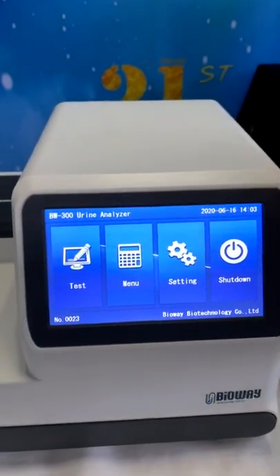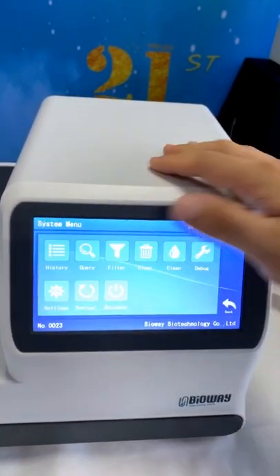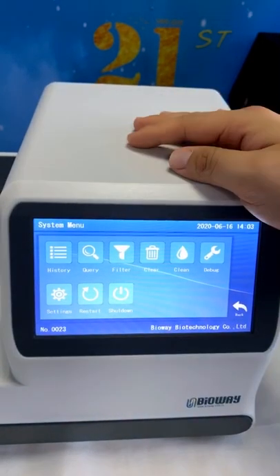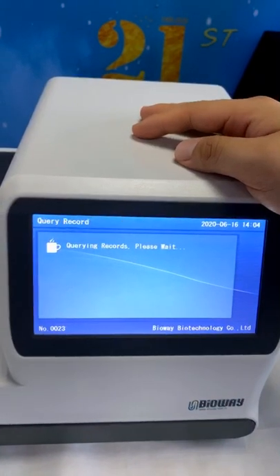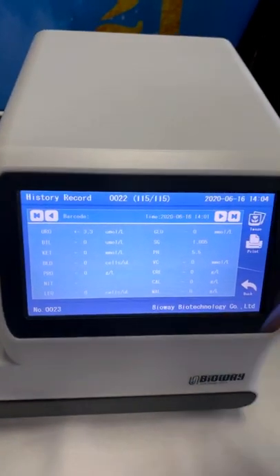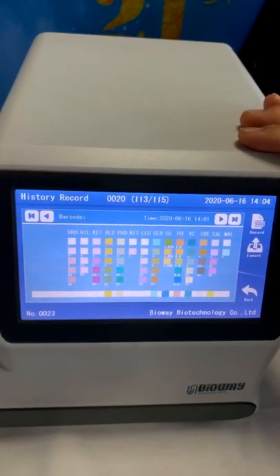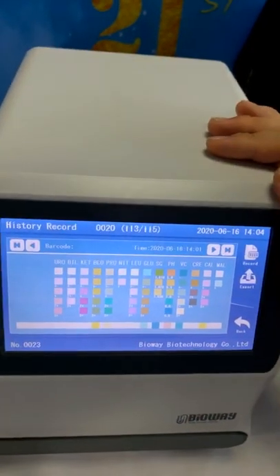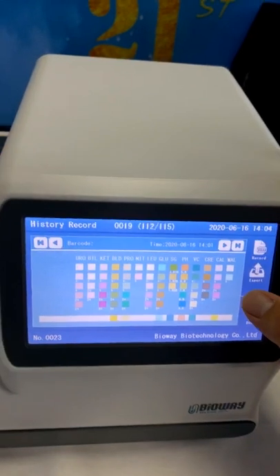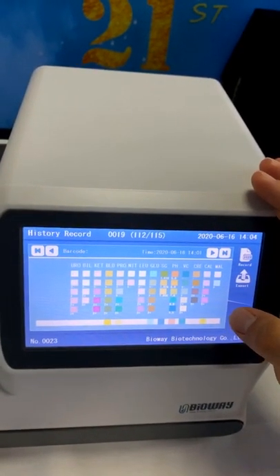As you can see, it's the main page of the BW300. In the menu, you can see the items history, query, filter, clear. For the history query filter, there are all the record searches. Press history record, and you can see the latest result, which we just completed. From the records, the image is still saved, so you can check the image immediately. For the 14 parameters, you can see the different colors. You can find the standard value, so they can identify which value it is going to be.